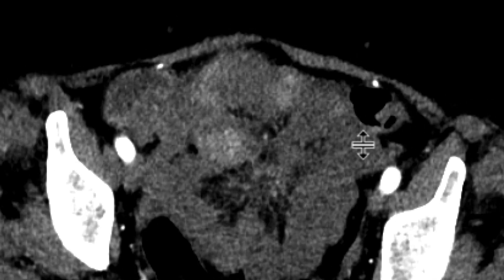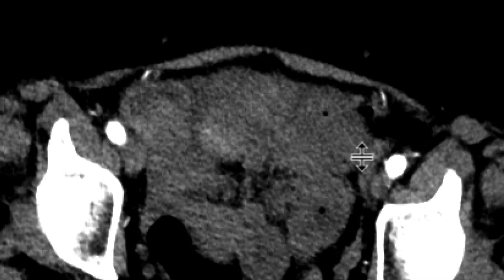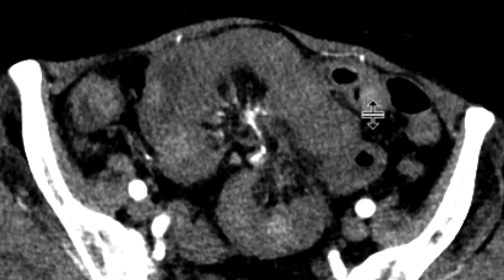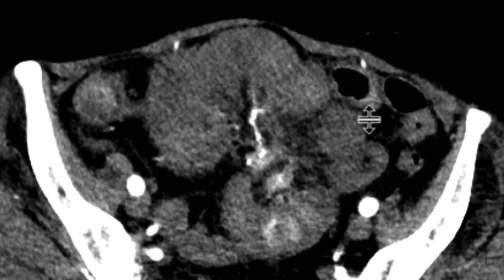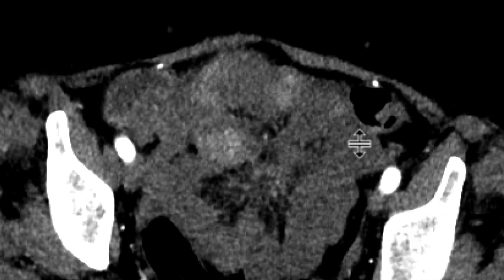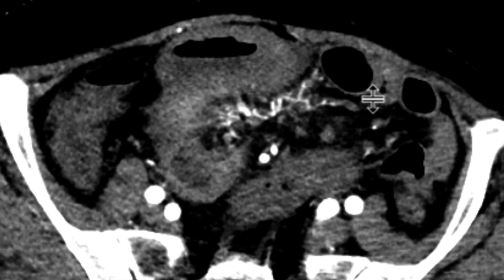There are multiple nodules of hyperattenuation within these loops of small bowel that are fluid-filled, distended, and tethered to this mass in the mesentery.